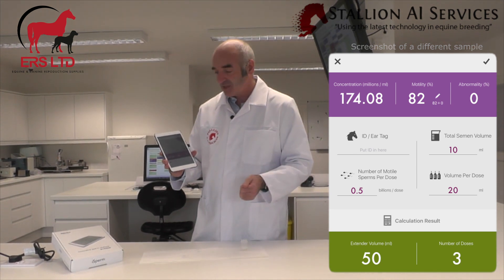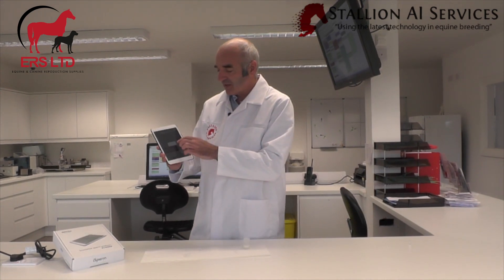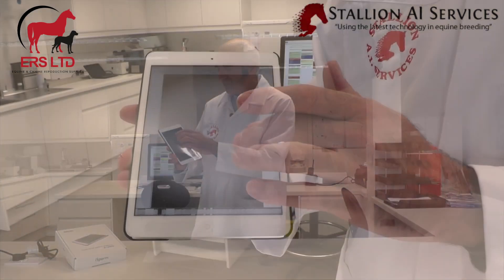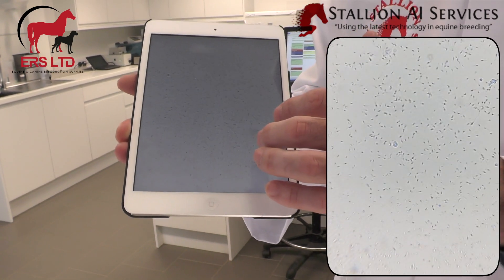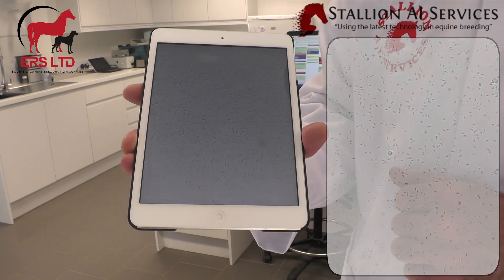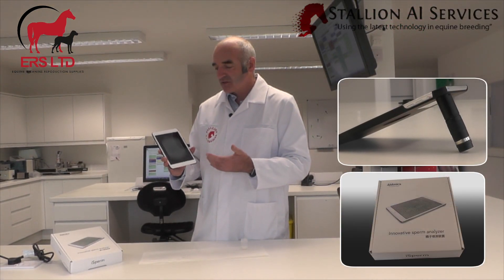You can see straight away it's given 45% motility with 319 million sperm per ml. This can be used in different extenders as well — it doesn't have to be done on raw semen only. It also stores all this data, so we can go back and look at it in our photos on the iPad, play it back, record it, and send it out if needed.